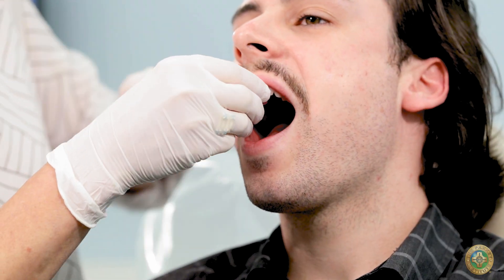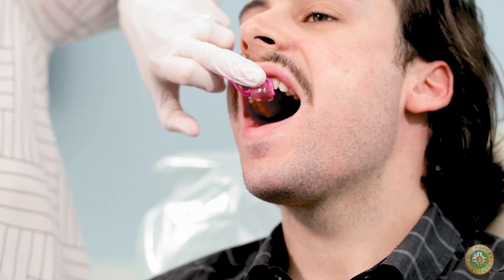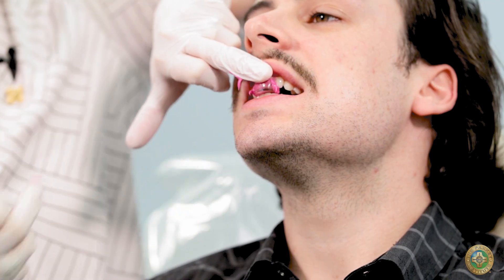I'm going to load the Panky Bite Stop and simply ask Dylan to open. I'm going to hold it on the labial and ask Dylan to bite his teeth together. I'm holding it on the labial to make sure that the platform stays parallel to the horizon in an anterior-posterior relationship, so that as Dylan bites into it, it doesn't tip up on the lingual and create an incline. The material takes about 45 seconds to set — you can get faster-setting bite registration if you like, or some set as slow as 60 seconds. I'll just keep applying pressure here on the labial until the Futar starts to set.